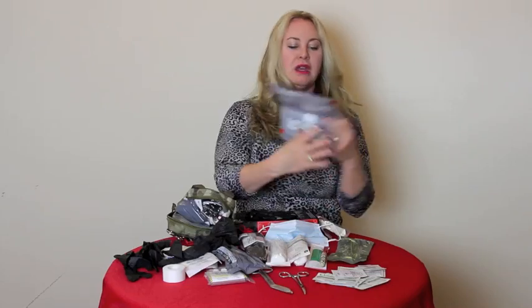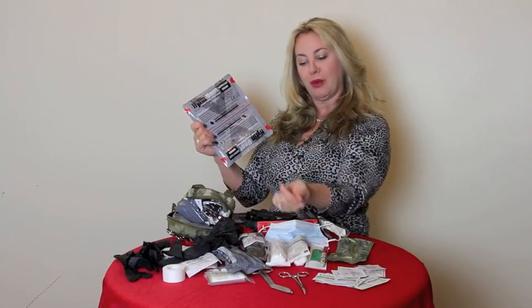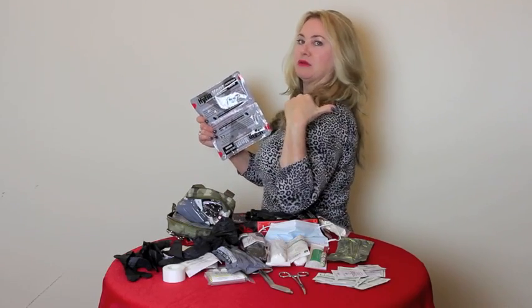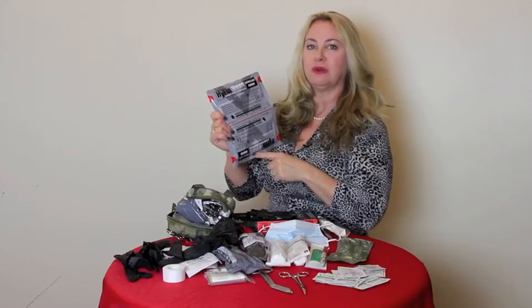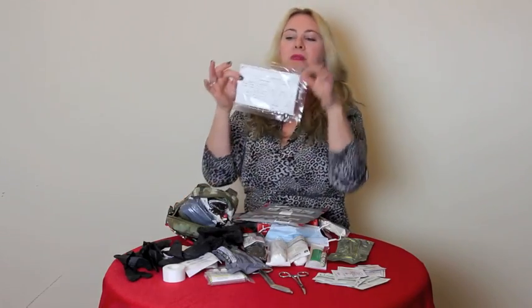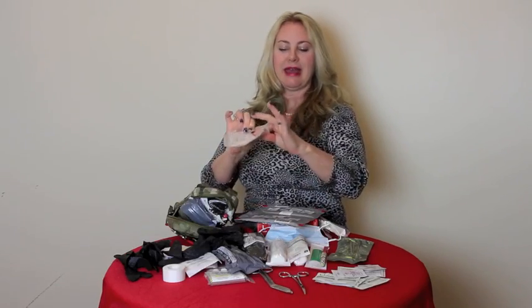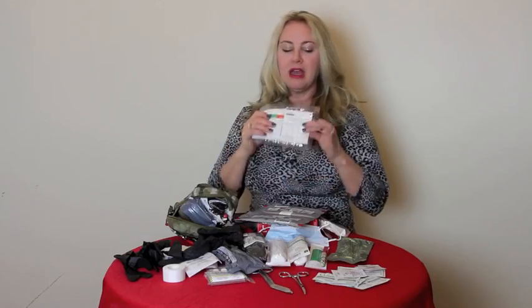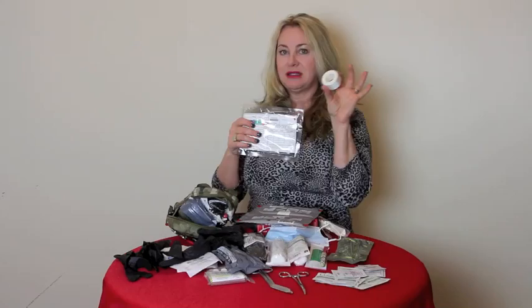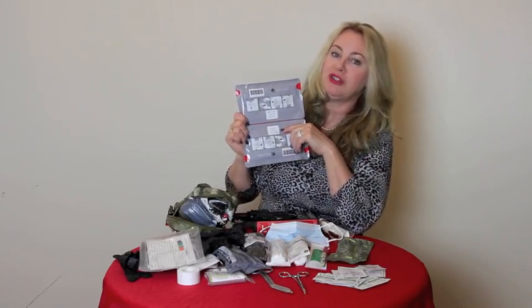Behind there is a double chest seal. Now why two? Well, if you've got a bullet hole that went in, or a stab wound, in and out the other side, you need two. These are vented. Now, you can make a chest seal from a plastic bag, and this would have two. You'd have to cut this in half. You could put one in the front, one in the back, and you would tape it with three sides adhesive tape.